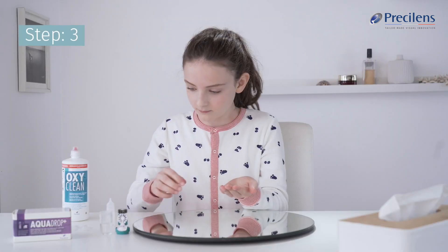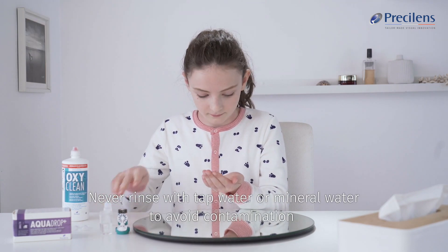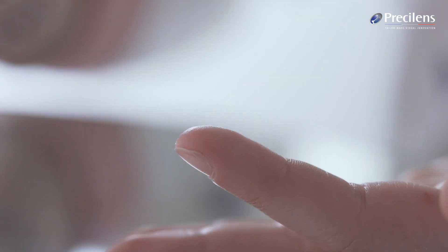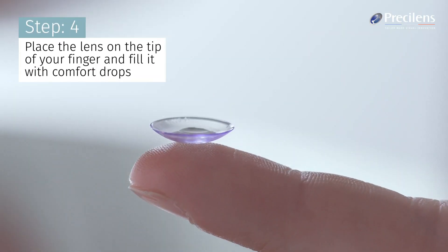The right lens is slightly purple. Rinse it with saline. Never rinse with tap water or mineral water to avoid contamination. Place the lens on the tip of your index finger and fill it with comfort drops.